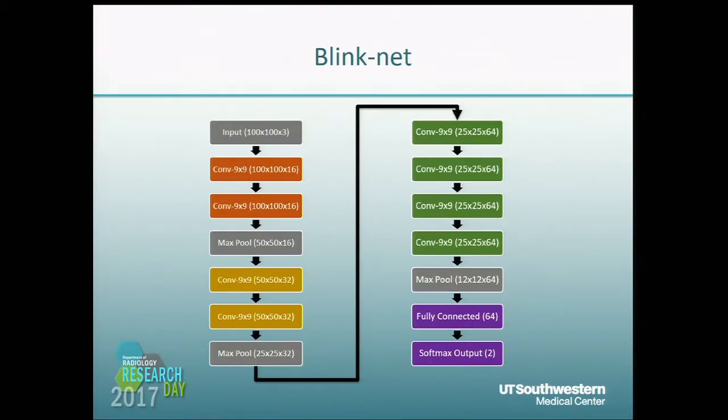Specifically, my question is before the softmax output, the last step, there's usually a probability involved in classifying whatever you have into one of those 2 categories. Is there any correlation with that probability with the quantity of artifacts present? No, we did not see any correlation there. Okay. So I have a couple of questions. Did you ever put anybody into the MEG machine and ask them to purposely blink many, many times? No, we did not. That might be something interesting to do.